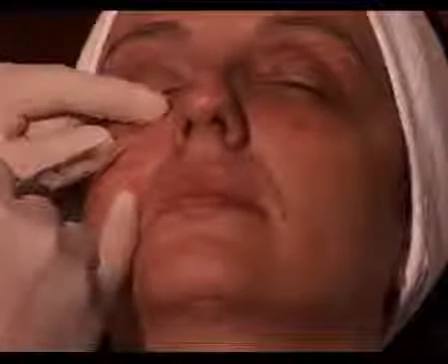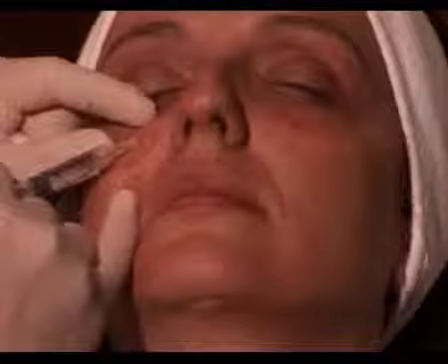So you feel the tear trough, you put your left non-dominant index finger on the orbital rim. This protects it, and at the same time does not allow the material to go into the orbital rim itself. You stretch the skin really well, you can see the capillaries, you try to avoid those capillaries. You're going to go in. Here I've touched a little bit of the bone, and that's what I'm going to be injecting. This area here you're going to be injecting is the preperiosteal space, okay? So that's the area that you're going to be injecting. And you put your mini bolus in there, and then you come out. So you can see hardly any bleeding happens because that area is really kind of devoid of blood vessels. Okay, so very, very safely in that sense.